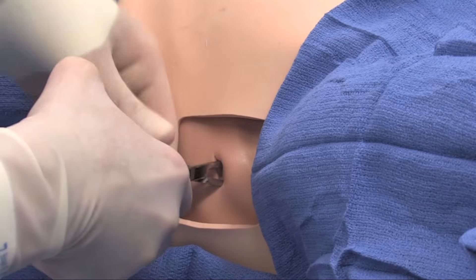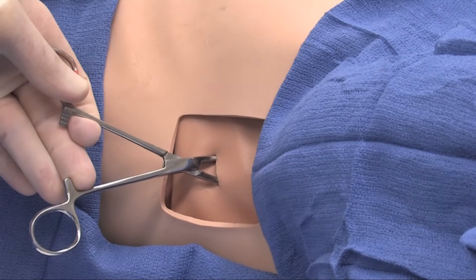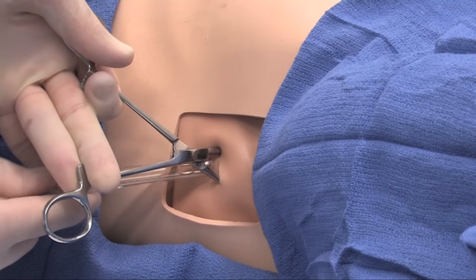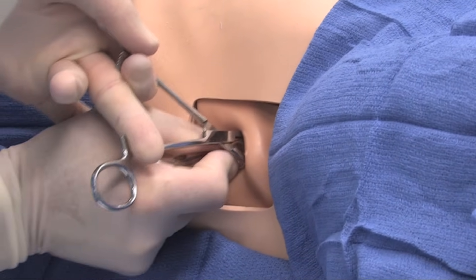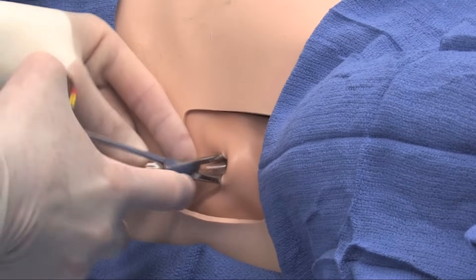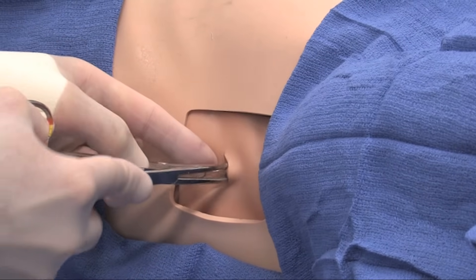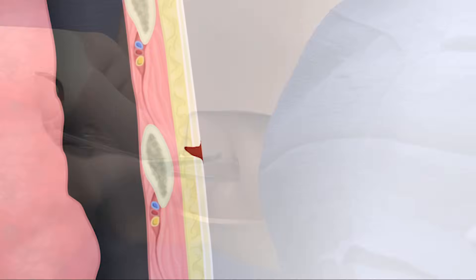Once you have adequate entrance into the pleural space, the clamp is left in as a bookmark to guide the passage of the chest tube, which is placed through the clamp itself and into the patient. Sometimes the chest tube will be assisted by placing the clamp around the tube to help guide it through the ribs and into the pleural space.